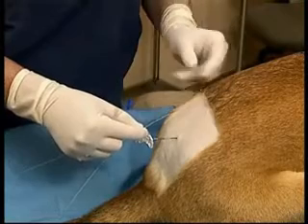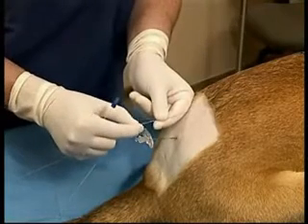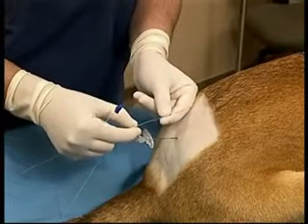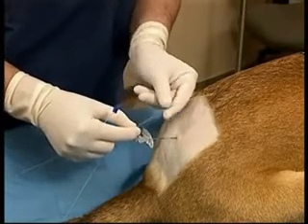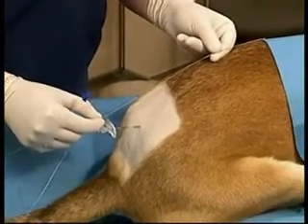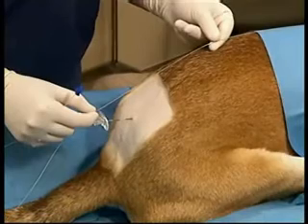Catheter should extend to about L4 for pelvic limb problems, to about L2 for abdominal surgery or abdominal pain, and to the level of T10 for those patients with cranial abdominal surgery or cranial abdominal pain or caudal thoracic procedures.